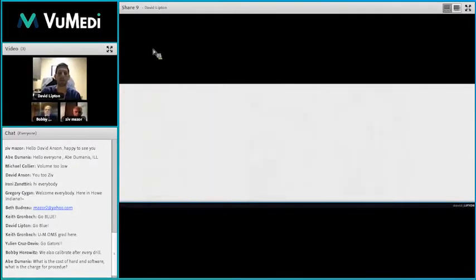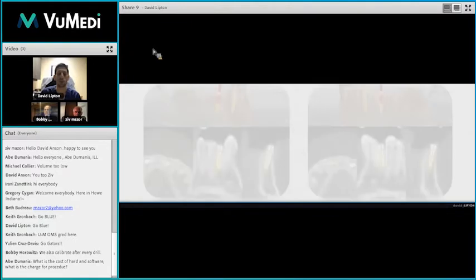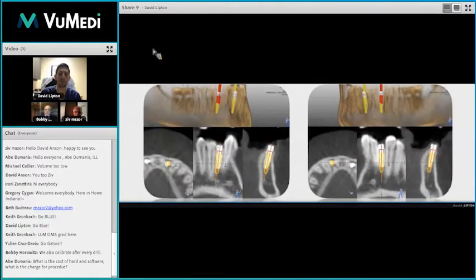Now, this is a little misnomer because we originally planned for deeper implants and longer implants, and we changed our plan. And that's another critical aspect of this software: you can change your surgical plan on the fly, whereas in a static guide, you have no control. Whatever you planned is what you're getting. And in this, you can change it and continue going back to your osteotomy.